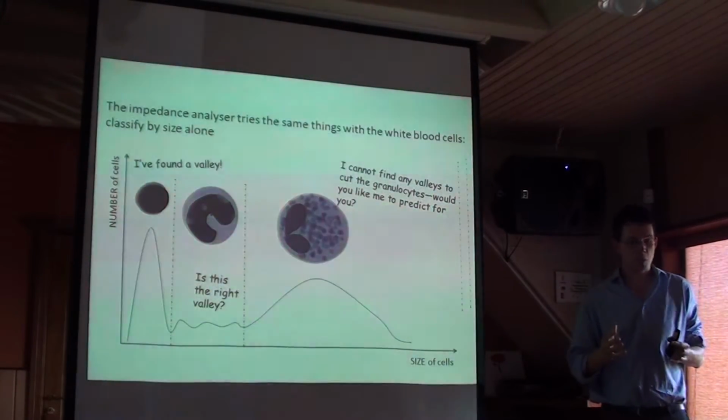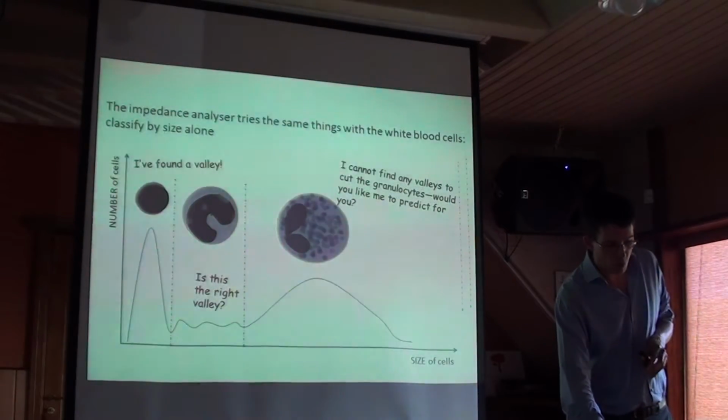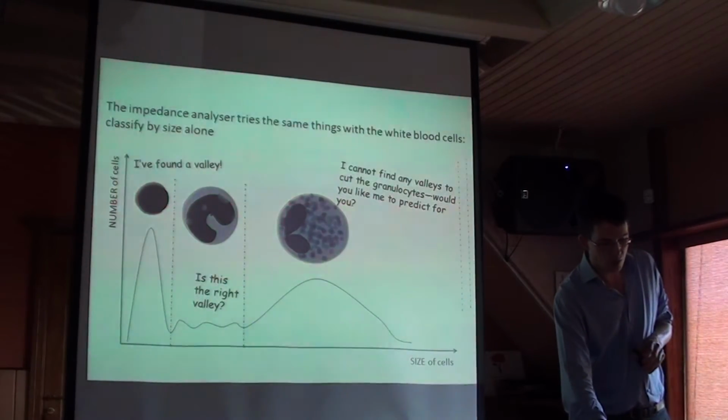But it's near impossible to sort out white blood cells by size alone when there is significant pathology.